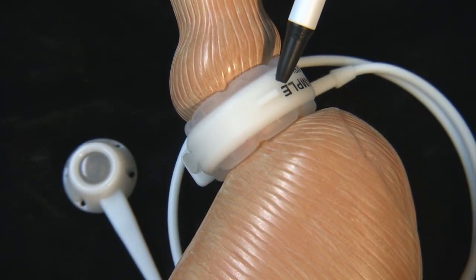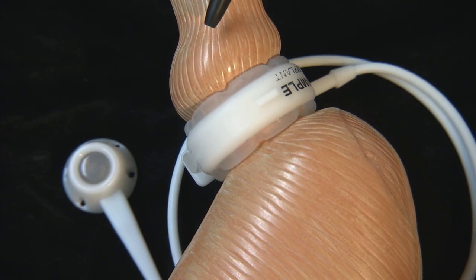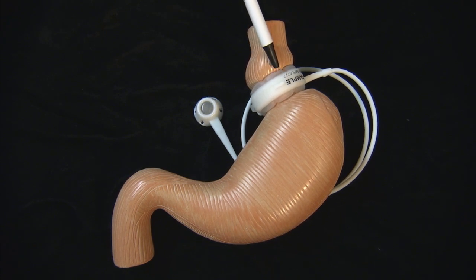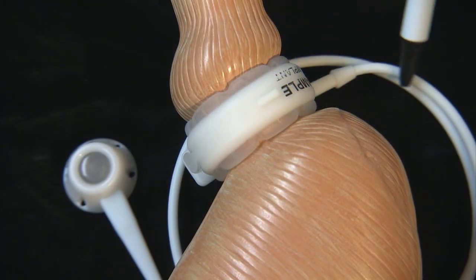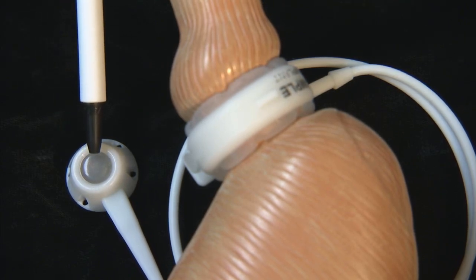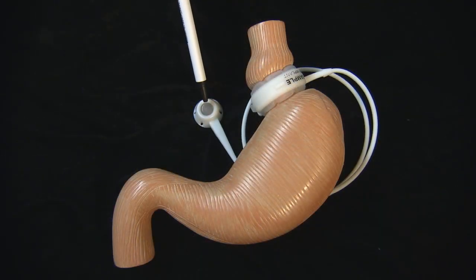Here's an adjustable gastric band in place with a small amount of stomach above it. The band works by having a balloon that is internal to the plastic ring that, when inflated, restricts the top of the stomach, thereby limiting how much a person can eat at one time. It's connected to a small plastic catheter that travels through the abdomen and is attached to a port which is buried under the skin by the belly button. This port can then be injected with saline to inflate the balloon.